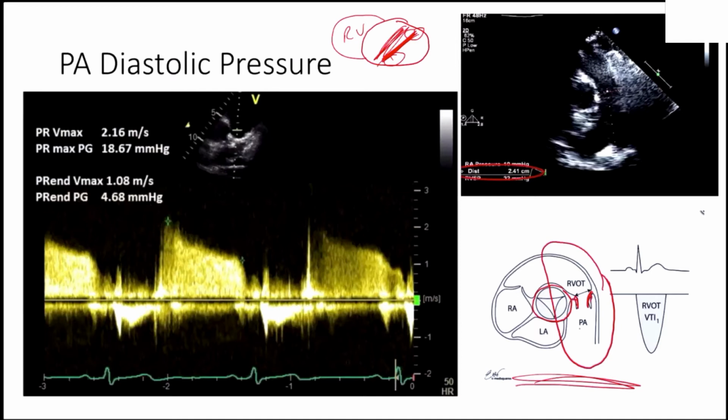Now, Kim did a really great echo yesterday in a patient with severe pulmonary hypertension, and she's smaller, and she had very good windows, and we were able to get great views of not only her main pulmonary artery, but her main right and left pulmonary arteries. And so if you find where your valve is, you're able to measure, just like you did your left ventricular outflow VTI, you're actually able to measure your RV outflow tract as well. And so this is where we start to see regurgitation, so blood flow going backwards, right, during diastole towards the probe. And so therefore we're going to have a positive deflection in our Doppler here, okay?